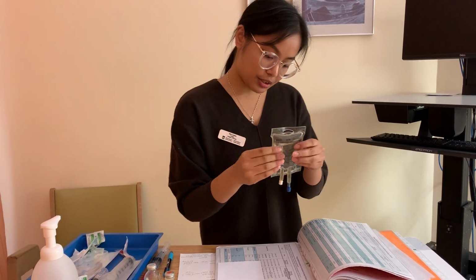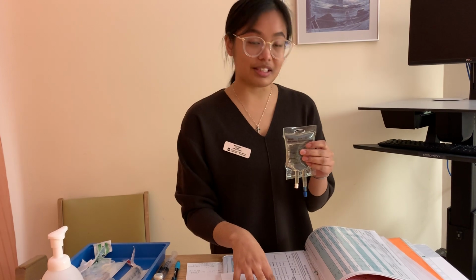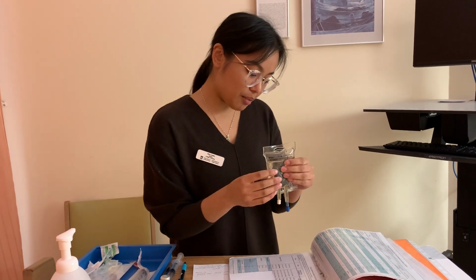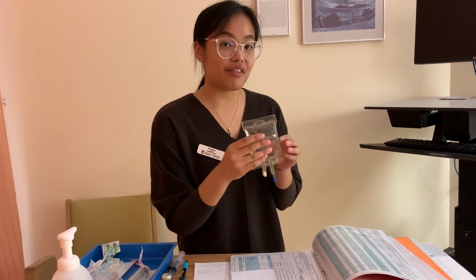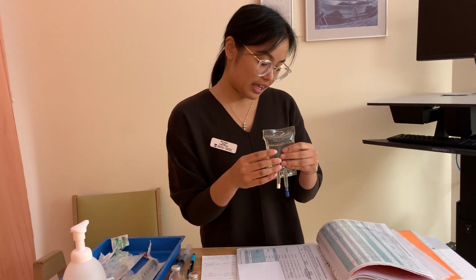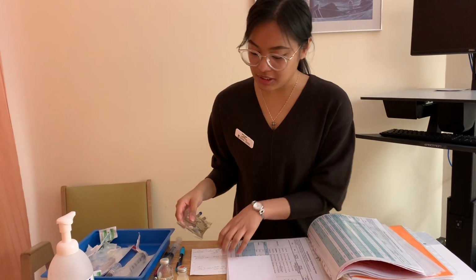I also want to give it for 29 minutes because that's what it indicates on the CIVA. I also want to make sure that I have enough time to fix any IV-related complications should those arise. And I'm also choosing a 25 ml bag because of my calculations, which I'll show you in the meantime. And as well, I'm going to show you it's going to be at normal speed.